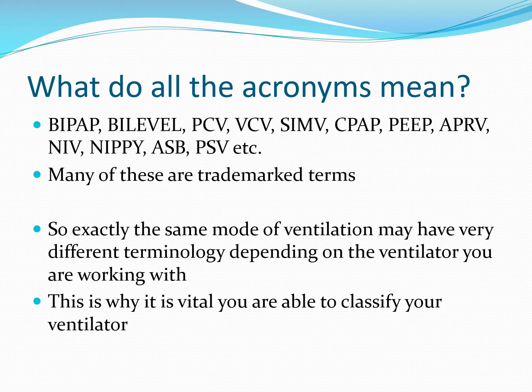So what do all the acronyms mean then? Well, the thing you need to get your head around is that most of these acronyms are trademarked. BiPAP and BiLevel, for example, mean essentially the same thing, but they're trademarked by different companies. The exact same mode of ventilation may well have very, very different terminology depending on the ventilator that you are working with. And that's why it's most important that you can classify your ventilator, far more important than any of these acronyms.